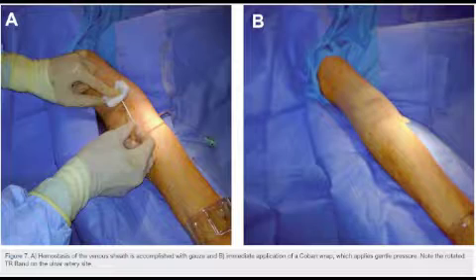Even though this is the end of the procedure, this is what it would typically look like, and this access point does carry the same complications as the radial and femoral access points. Now that the physician has successfully gained access into the patient's heart and found the blockage causing the problem, they have three options. They can either do a drug-eluting ballooning, a drug-eluting stent, or a bare metal stent, and I'll go into greater detail on these three options coming up.